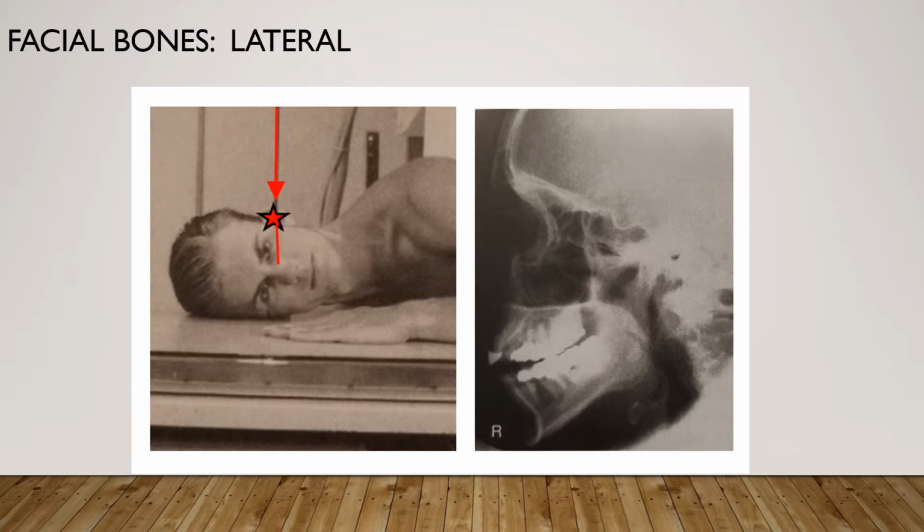You can actually have the patient positioned seated or on the table. Adjust the head to a true lateral with the side of interest closest to the IR. Adjust the mid-sagittal plane parallel to the IR. The interpupillary line is perpendicular to the IR. Adjust the chin to place the infraorbital meatal line parallel with the bottom of the IR.